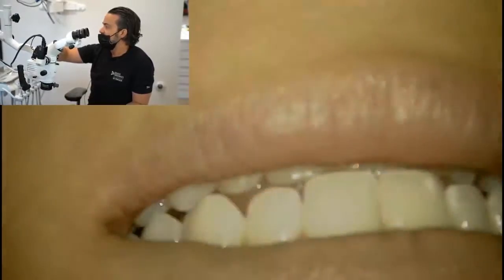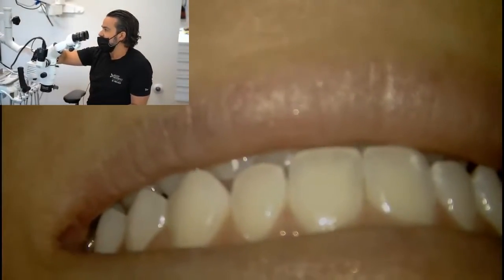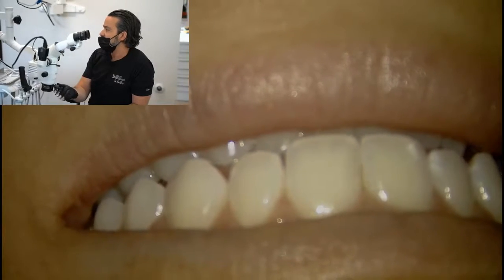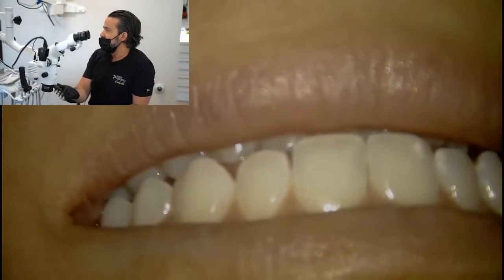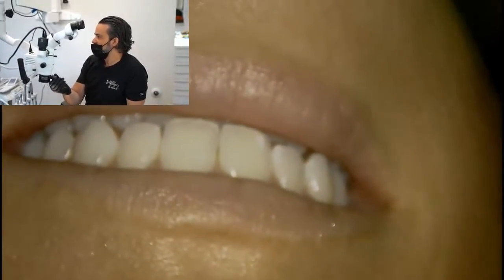If I were to crank this up, now this monitor is going to actually filter some of this brightness out just by the way that our technology is in this room. But it can get really warm.